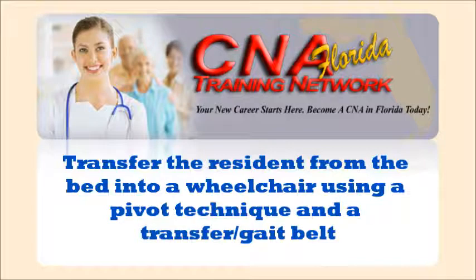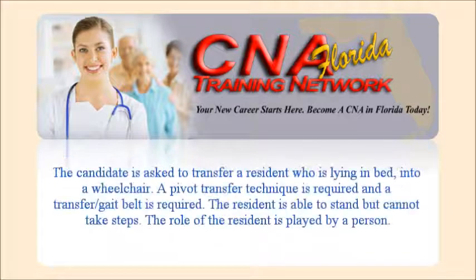One of the skills you may be asked to perform when you take your state exam is to transfer the client from the bed into a wheelchair using a pivot technique and a transfer gait belt. The client is able to stand but cannot take steps. The role of the resident client is played by a person. The checkpoints the state evaluator will use to evaluate your performance are listed at the end of this video demonstration.